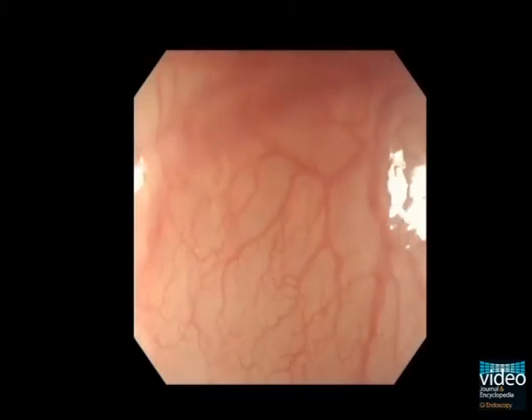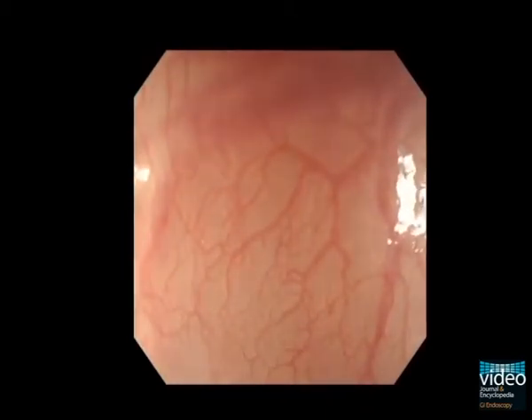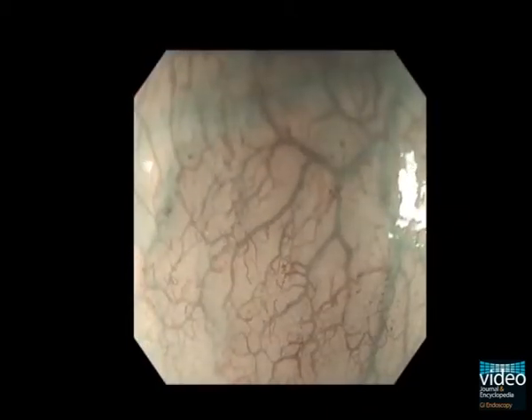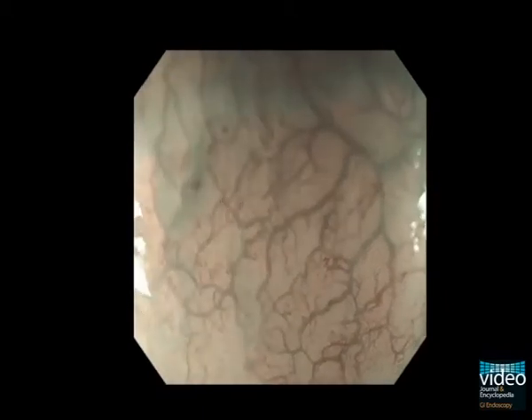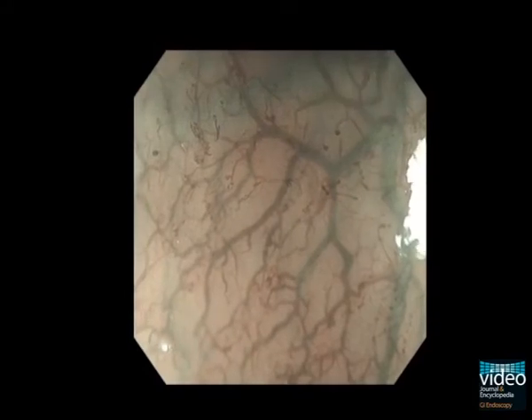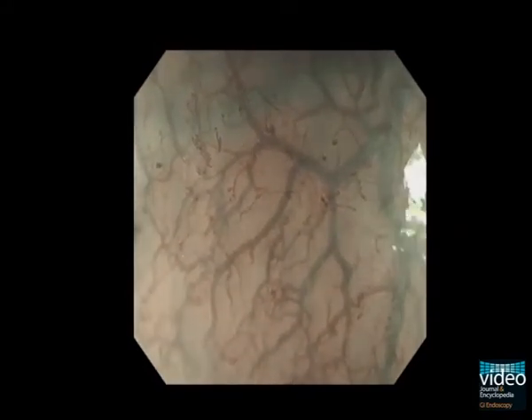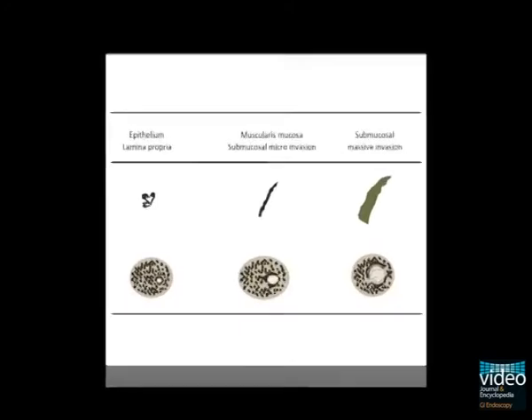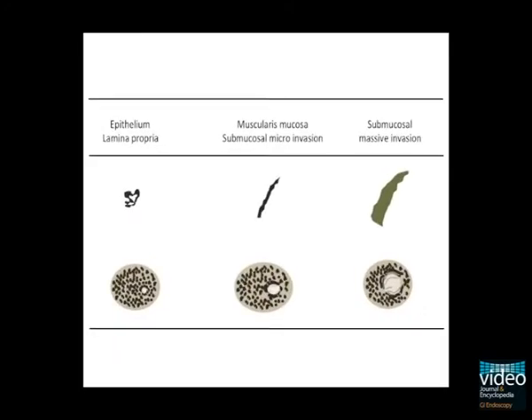Narrowband imaging provides a clear image of the mucosal surface in esophageal cancers. The mucosal microstructure changes dramatically with the development of cancer. Diagnosis and prediction of infiltration depth in esophageal neoplasias can thus be achieved by observing the architecture of the esophageal microvasculature. This video presents the diagnostic process for esophageal squamous neoplasia based on the new Japan Esophageal Society classification.